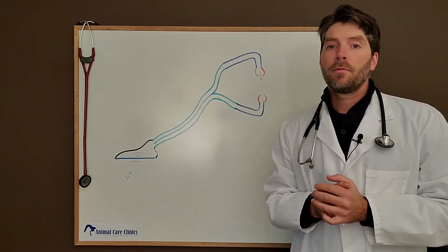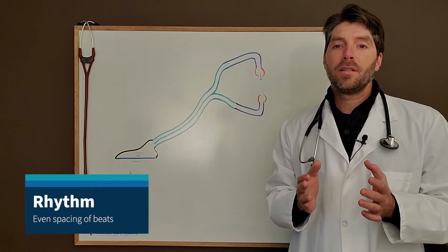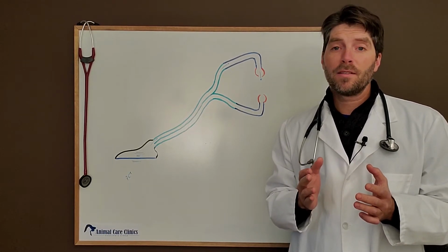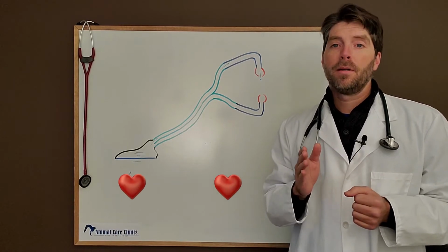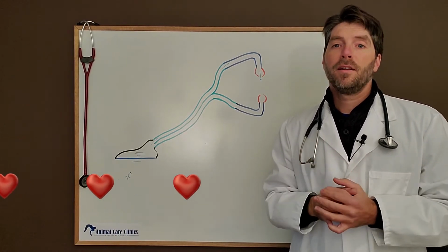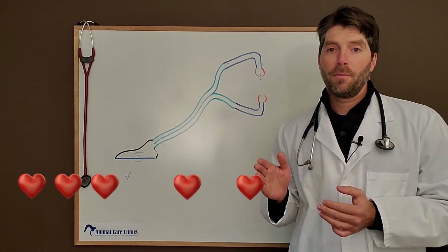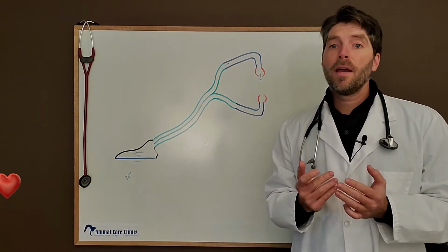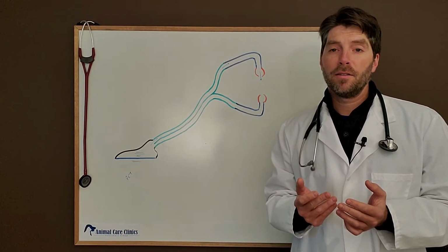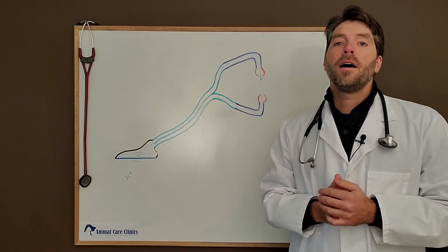We hear the rhythm. So the rhythm is how even are the beats spaced. For example, if we hear thump, thump, thump, thump, it's a nice even rhythm. If we hear an uneven thump, thump, thump, thump, that's an abnormal rhythm and something we probably want to look into. The final thing we listen for is the quality of that beat.